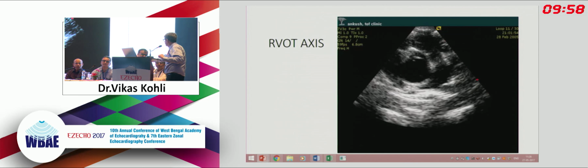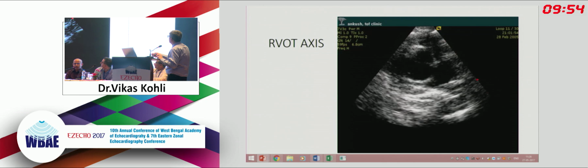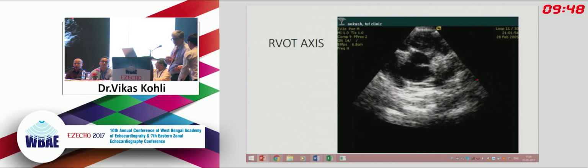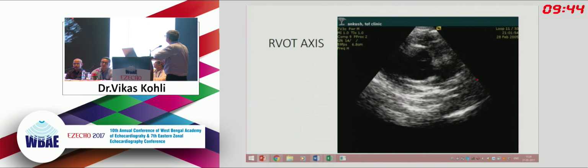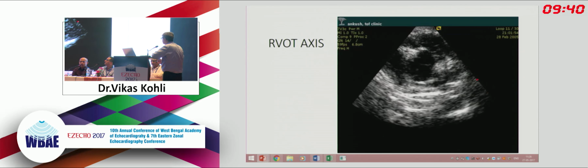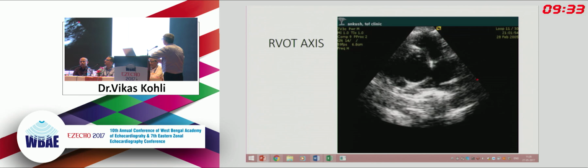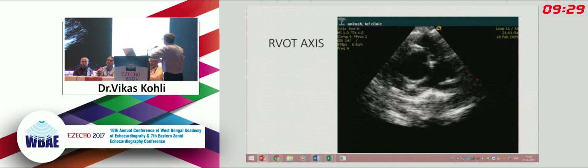Go ahead. So in this case, we need to take the valve annulus in a still picture and measure it with the Z-score, whether the valve can be spared or not. If the valve can be spared, that saves a lot of hassles for the child, because they will be spared of the pulmonary incompetence, which will spare the future prospects of pulmonary valve replacement, if the transannular patch is spared, if the valve can be kept. Otherwise, we'll go for a transannular patch repair, including whatever patch the surgeon prefers in that particular institution.